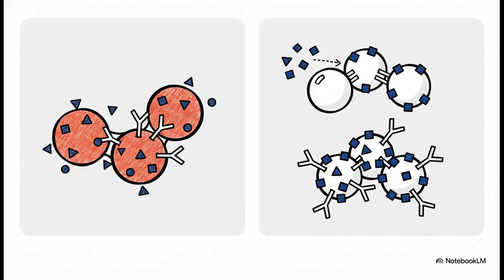While direct agglutination involves the native antigen interacting directly with the antibody, which is fantastic when your antigen is already on a large particle like a red blood cell, indirect methods cleverly hijack carrier molecules to amplify the visible effect. In indirect or passive agglutination, we take soluble antigens that would normally just form weak precipitates, and we literally coat them onto larger carrier molecules, like red blood cells or synthetic polystyrene latex particles.